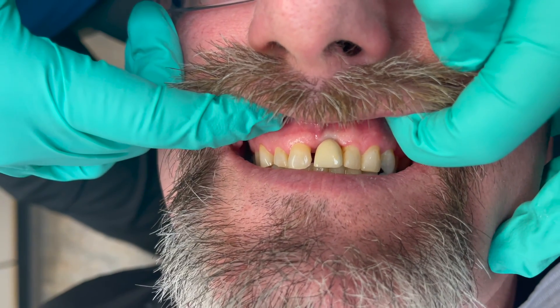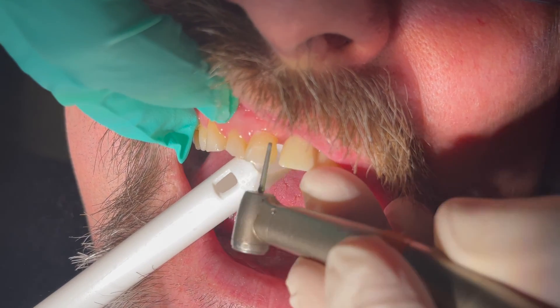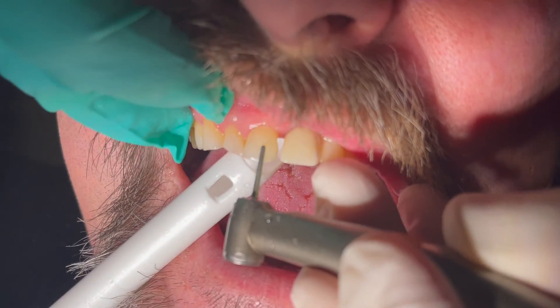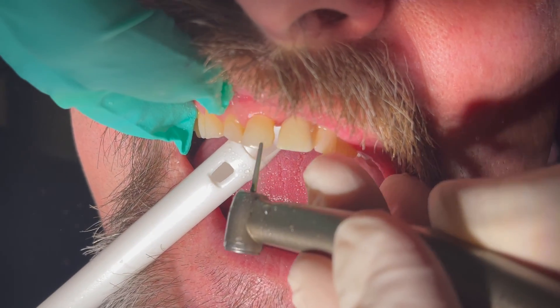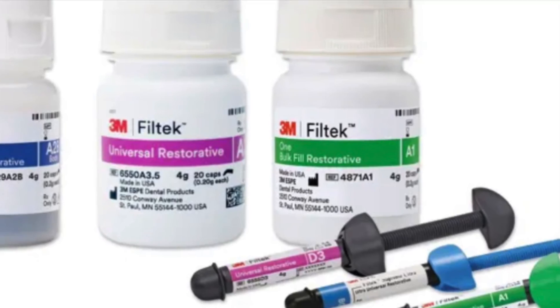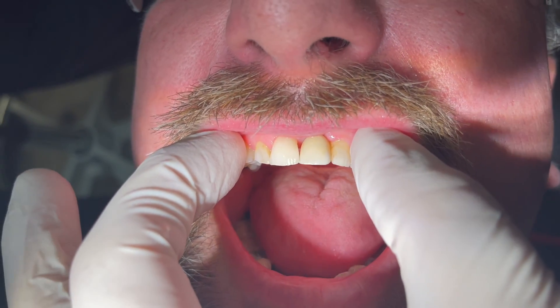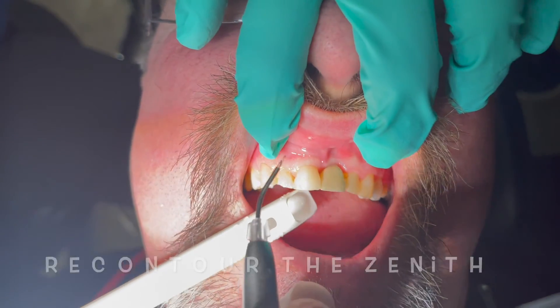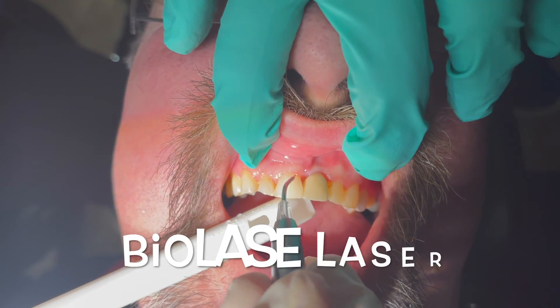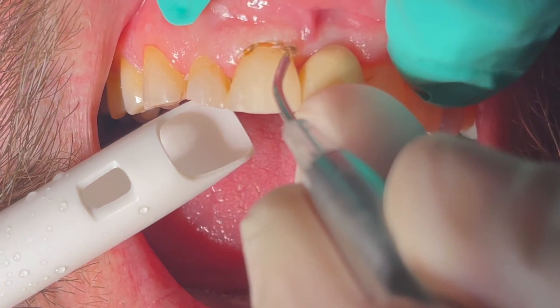You can see one crown is larger than the other. We've planned the crown space based on our emergence profile created in DTX. I'm going to use some restoration now to create the emergence profile, and hopefully the patient will get a crown done on number 8, because that's the ideal thing — but he can't afford that right now, so we're going to doctor this up and make it look better. We'll use some Filtech Universal restorative material to fill the tooth itself and bulk fill in the back. I'm using my BioLase laser to shape the tissue, making sure I keep at least one millimeter of sulcus, and going across to do the emergence profile to match my implant system.